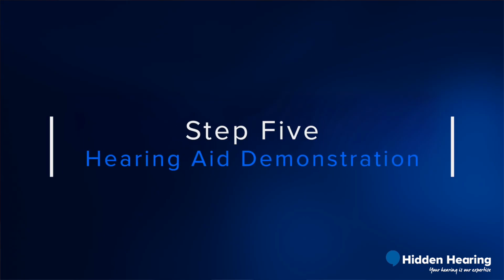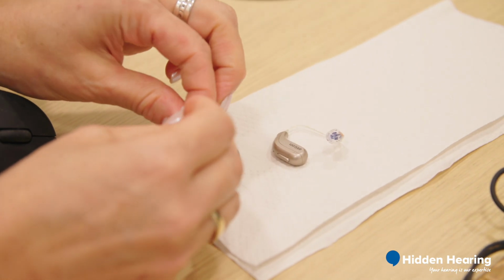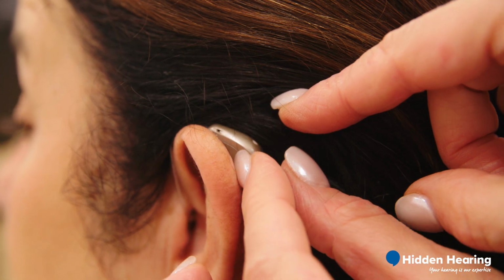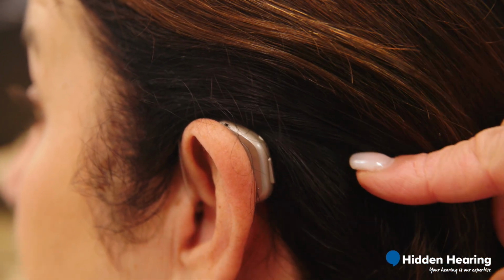Step 5 is the hearing aid amplification demonstration. During that part, what we do is we demonstrate if hearing aid amplification is needed and what difference it would bring to the patient. The reaction can be so emotional. We've had tears in the room, we've had laughs, we've had, "I don't believe this. Is this the way she normally talks?" The reaction is overwhelming. It's really what makes it worthwhile. It's what makes me get out of bed in the morning.